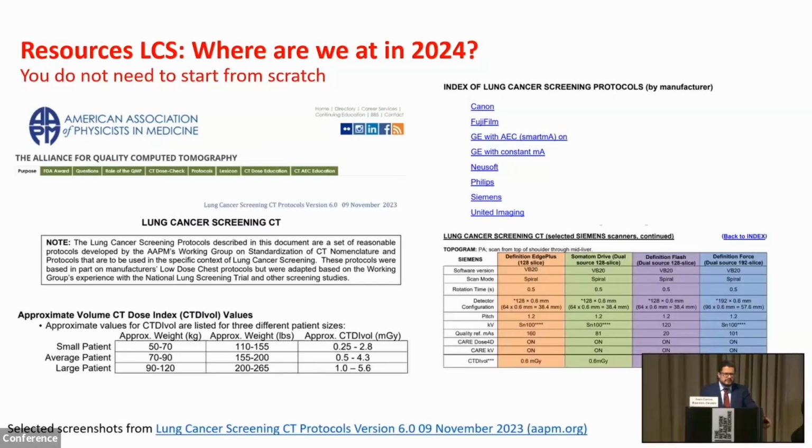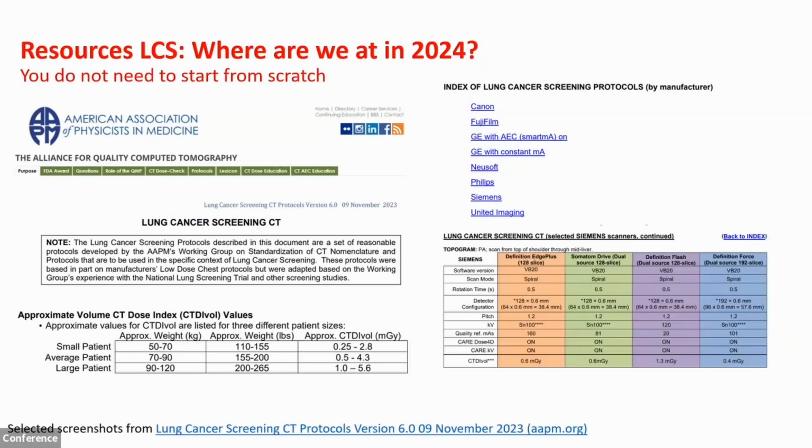Again, for many of them, you'll find a very specific description of how to do the acquisition and different recommendations. There is, however, one important miss, I guess, in some of these protocols: not every feature, especially in the reconstruction, might necessarily be targeted for quantification. And I think there are a few of those protocols that maybe miss the mark on that, I must acknowledge.